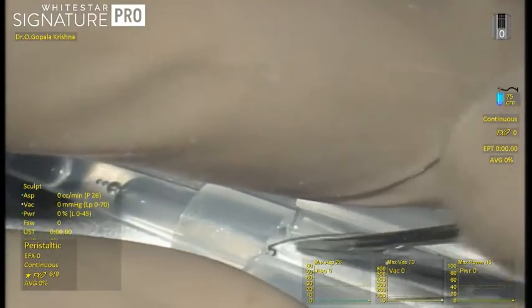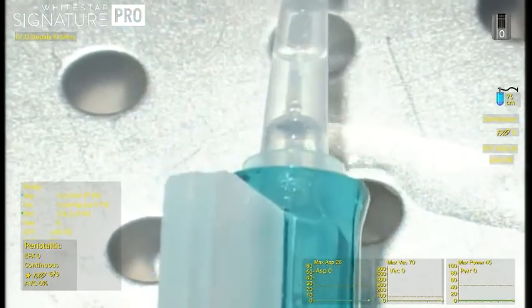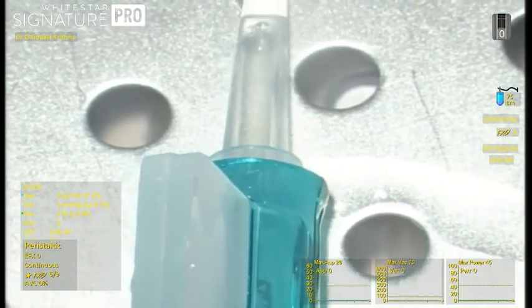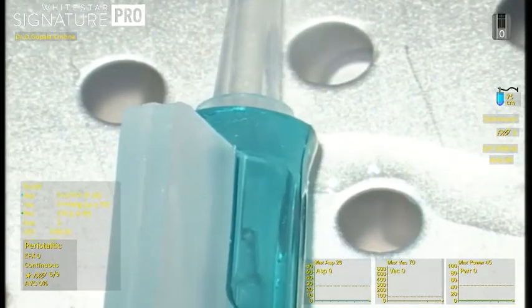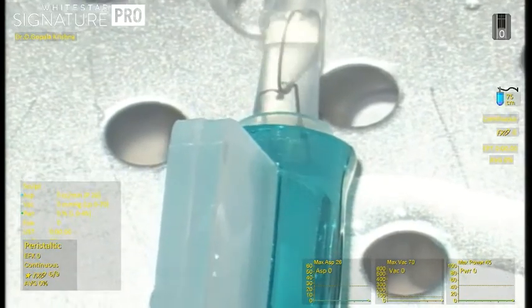The single-use Gupta's pupillary expander ring comes with a disposable injector exclusively designed for it. It is easy to load the ring into the injector, just like loading an IOL into the cartridge. Once the ring is inside the cartridge, push the cartridge plunger in to see the leading edge of the expander ring.